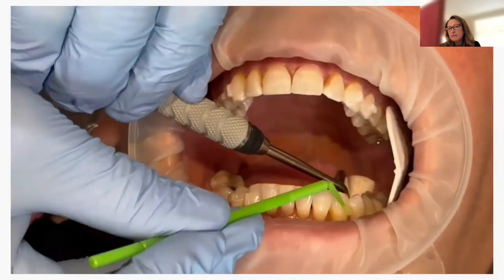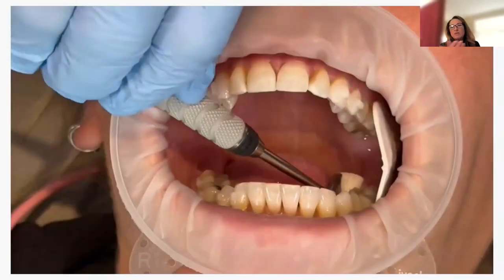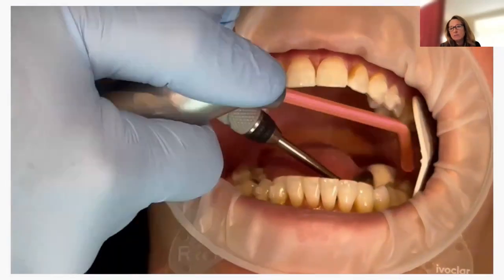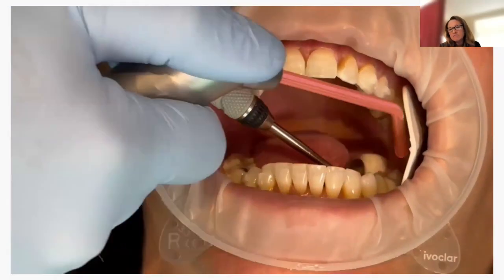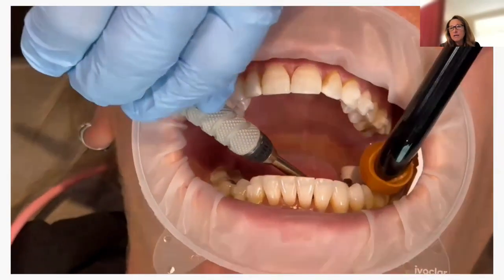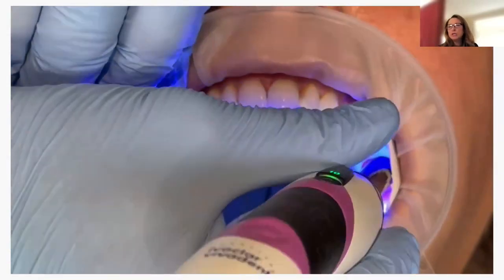So I would say, like my delivery of my aligner cases that I did, depending on how many attachments I had, some I would allow a 20-minute block, some a 30-minute block. Most of it was 30. And if I had enough time, then I would do patient education.